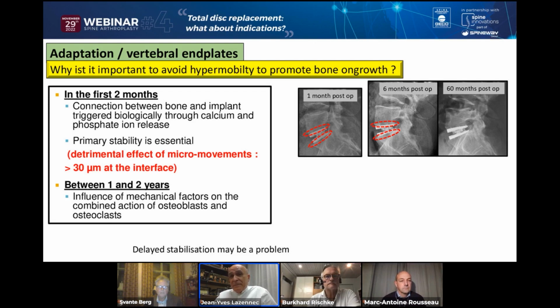As for a hip, micro movements have been very well defined for the hip. You have here in red the limit for micro movement. You can say it is very difficult to have a good measurement of those micro movements, but we must be aware of this.